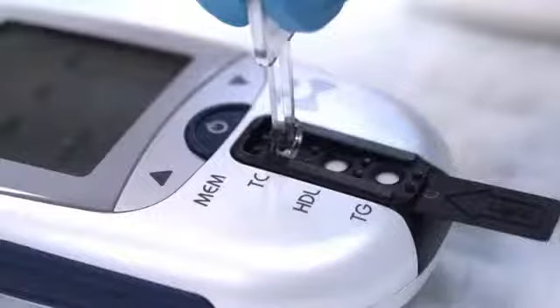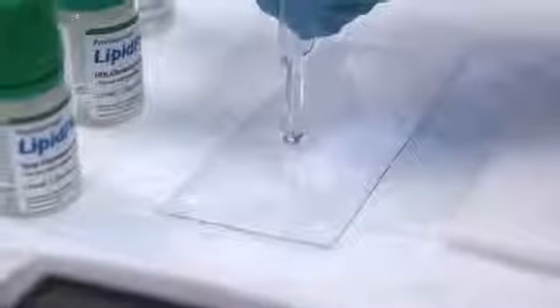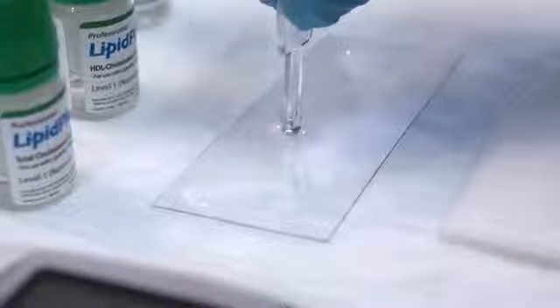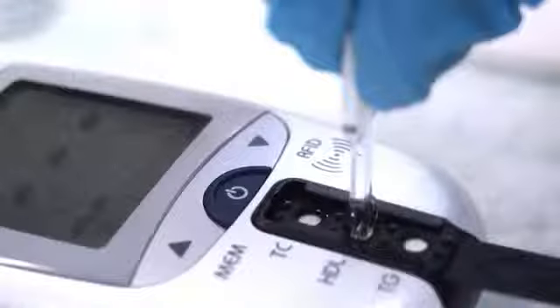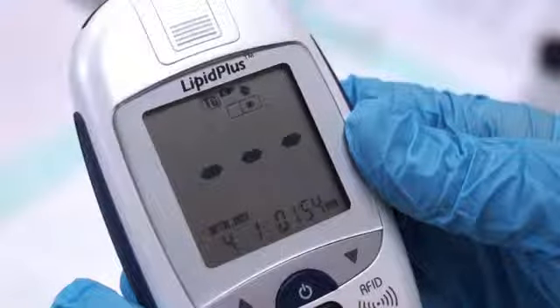First, apply the total cholesterol control solution to the total cholesterol test area of the test strip until you hear a beep. After it has been absorbed, the symbol for cholesterol will disappear from the screen. Using a new capillary rod, apply the HDL cholesterol control solution to the HDL test area of the test strip until you hear a beep.